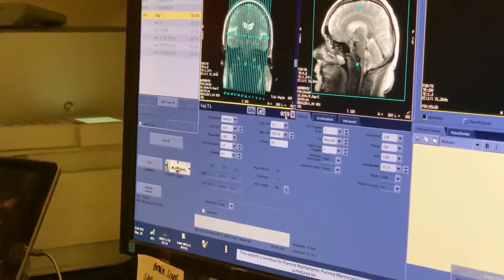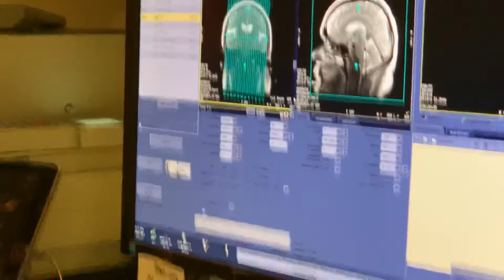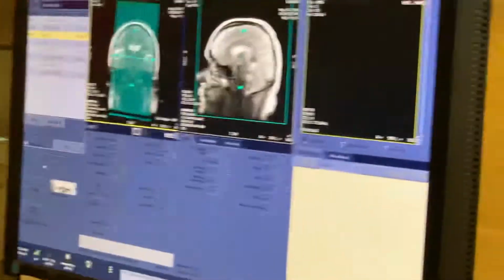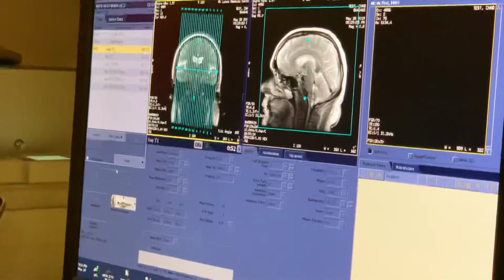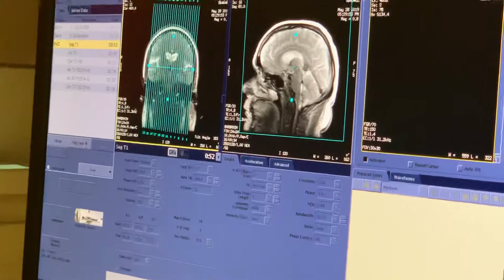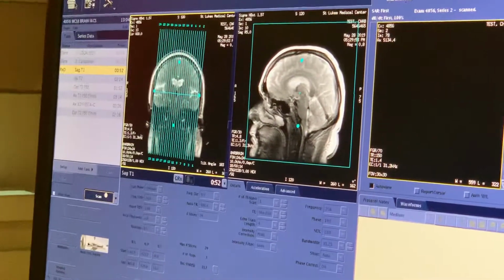I'm already satisfied that this is a minute long, so I'm just going to go down to 256, 192. I'm going to keep it at 52 seconds since we're going to use this to plot later, so I'm going to want to have an image that isn't too grainy. So, all right, this next scan's about a minute long. Hold very still. Oh, I need to check that I'm going from left to right. I neglected to do that.